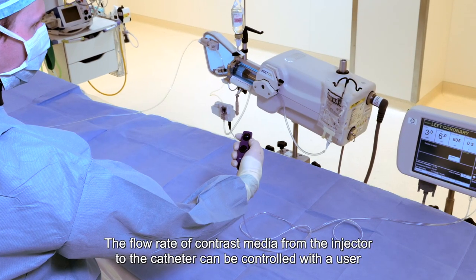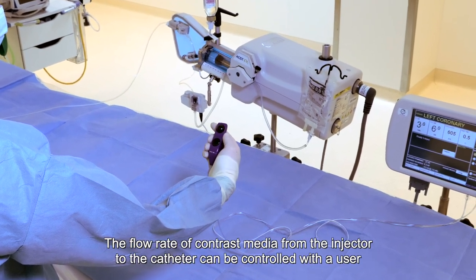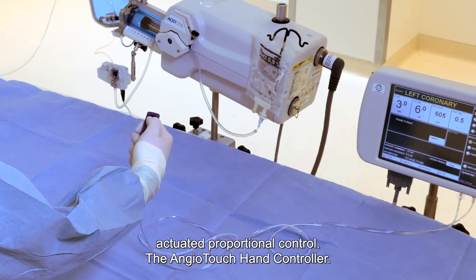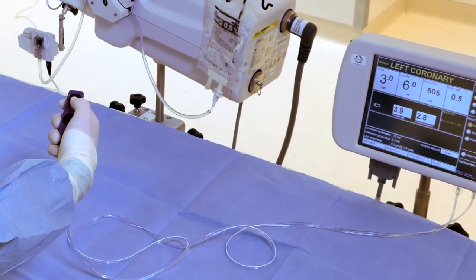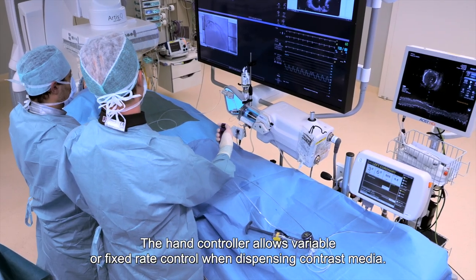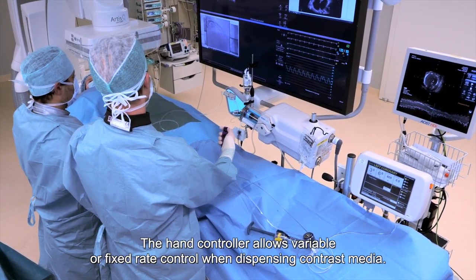The flow rate of contrast media from the injector to the catheter can be controlled with a user-actuated proportional control, the AngioTouch hand controller. The hand controller allows variable or fixed rate control when dispensing contrast media.